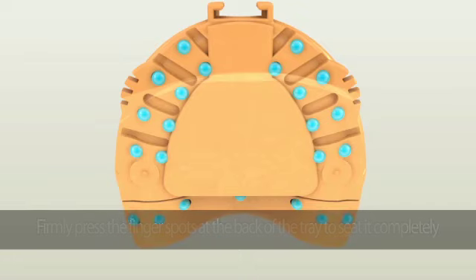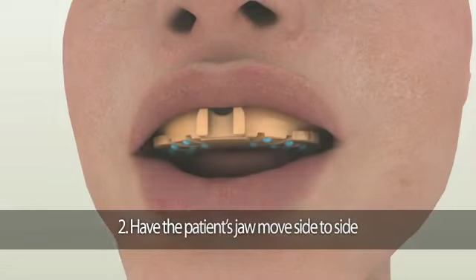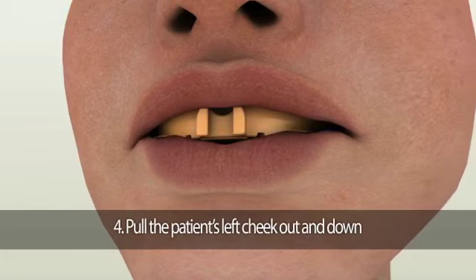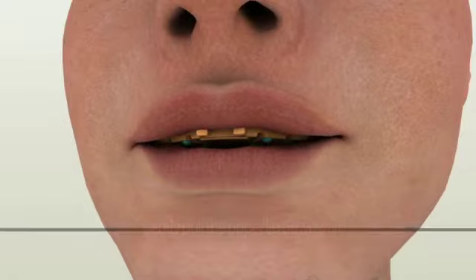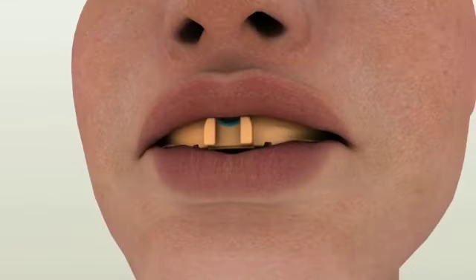Once the tray is seated, perform border molding procedures. First, have the patient open their mouth wide and then close. Second, have them move their jaw side to side. Third, pull the patient's right cheek out and down. Fourth, pull the patient's left cheek out and down. Fifth, gently pull the upper lip downward so the membranous attachments and frenums are activated. Repeat these border molding movements three to four times until the material is set completely. Setting time varies by manufacturer, so check your PVS impression material instructions.